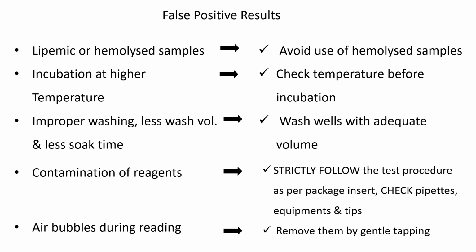Incubation at higher temperature: check the temperature before the incubation. Improper washing, less volume of washing or less soak time: wash the wells with adequate volume. Contamination of reagent: we have to strictly follow the test procedure as per the package or the manufacturer and check the equipment. Then air bubbles during reading, so we have to remove these air bubbles by gentle tapping.